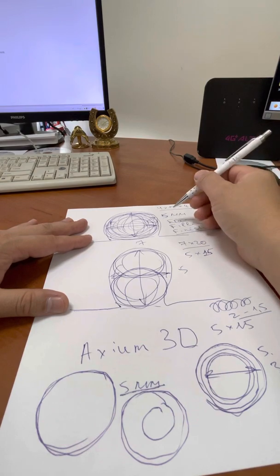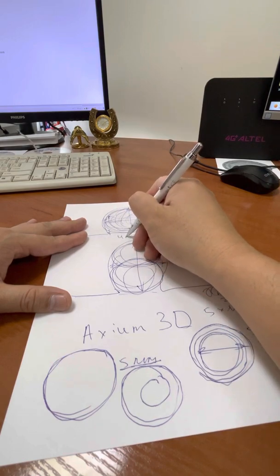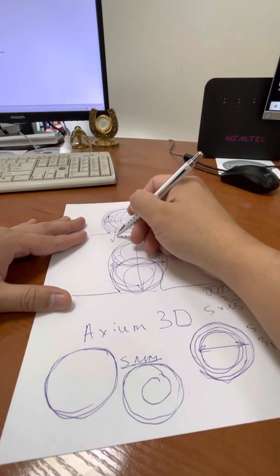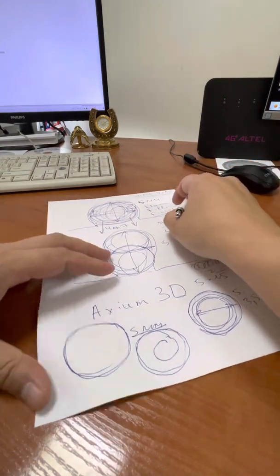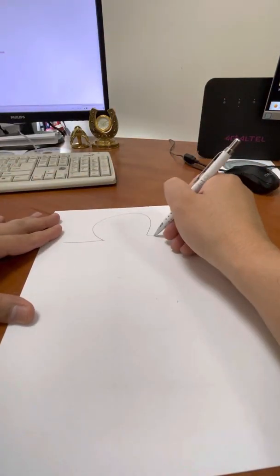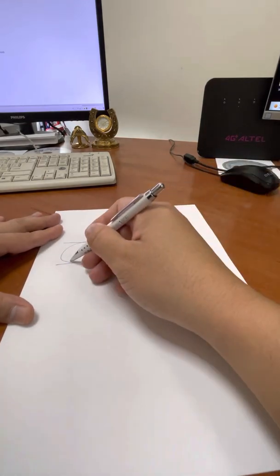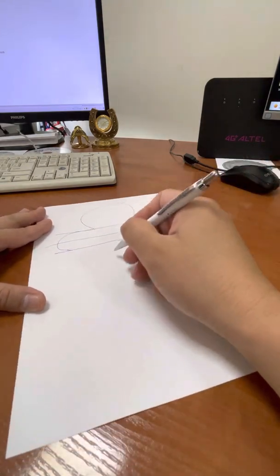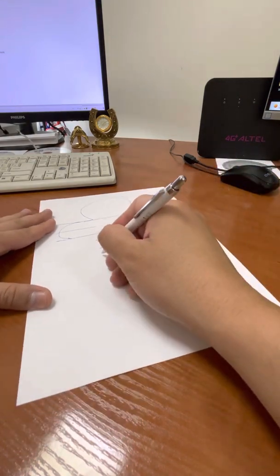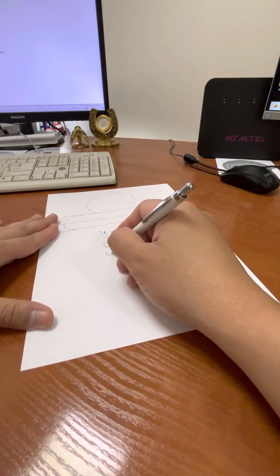it's more comfortable, but you need to keep in mind if the neck is 4 millimeter and the aneurysm is 5, there could be a small migration, and that's why in all of this type of aneurysms, in ruptured aneurysms, I prefer to take balloon assistance. And the size of the balloon, if it's a Hyperglide, it's 4x15, it's a universal one. For the Eclipse, it's 6x15, and for the Scepter balloon it's 4x15.